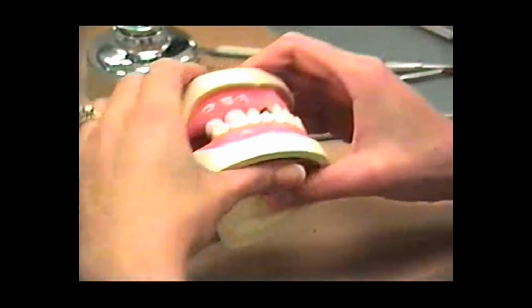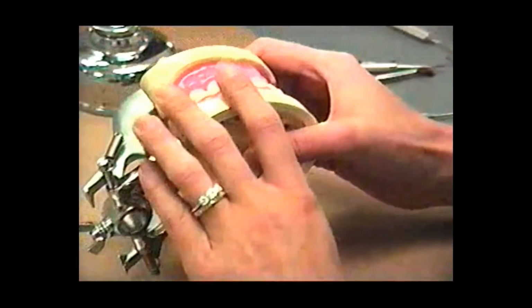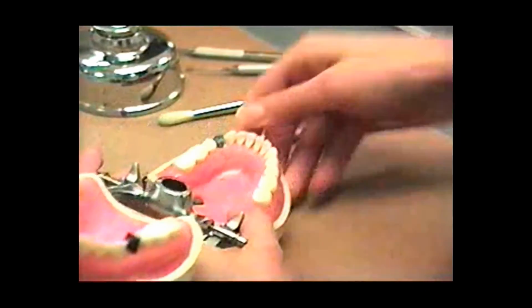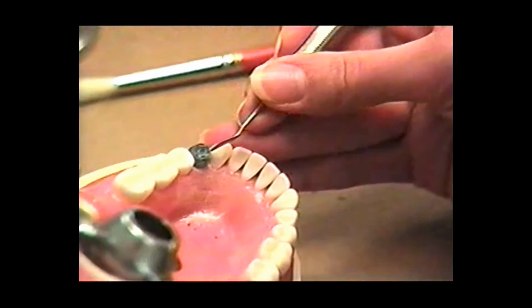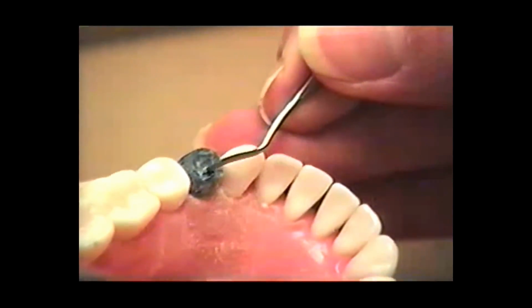Came down a little too far. You guys have had this experience, I know. Came down a little too far on the cusp tip contact. We could add to that. We're very close to where we need to be. Now there's one other thing we need to check.